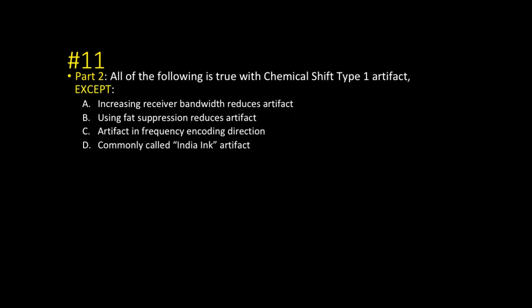Part 2, all the following is true with chemical shift type 1 artifact except... commonly called India ink artifact. That is associated with type 2. All the other options, A, B, and C, are true of type 1 spin echo chemical shift artifact.